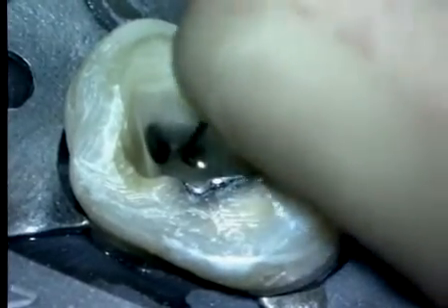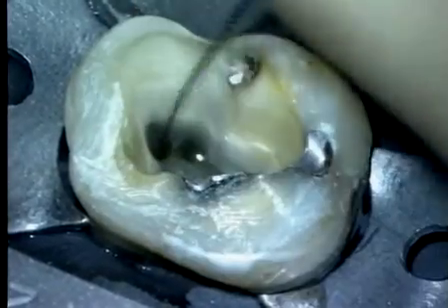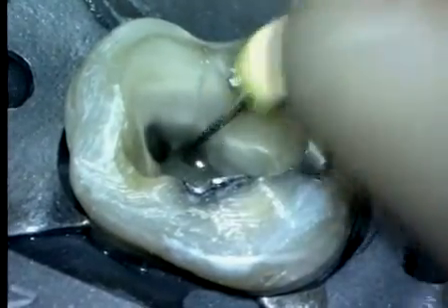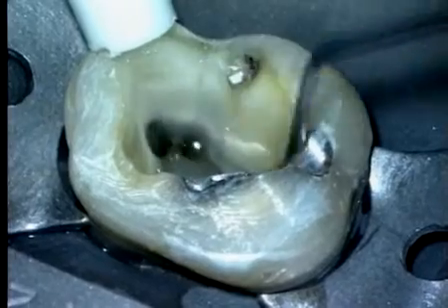Again, a small 10 hand file is carried into the canal, worked up and down in both systems because the systems may in fact be common in their apical 1/3. The 15 file follows, and again it's moved up and down in short amplitude strokes to move debris into solution so it can be effectively liberated from the root canal space.